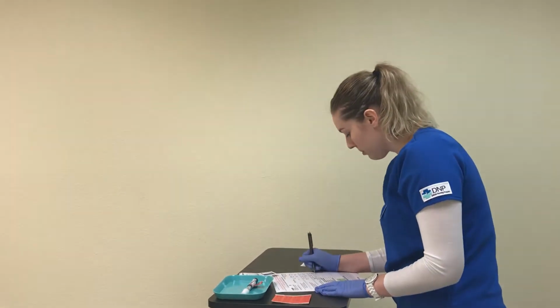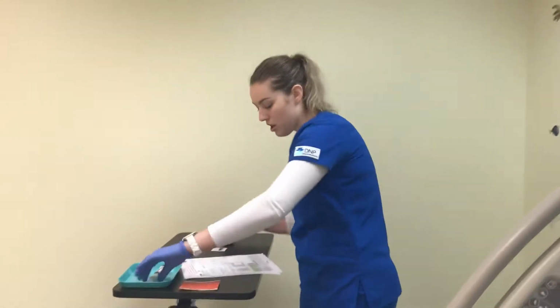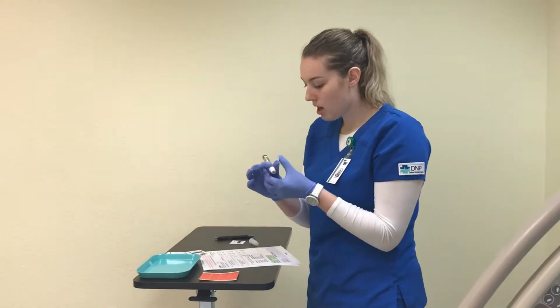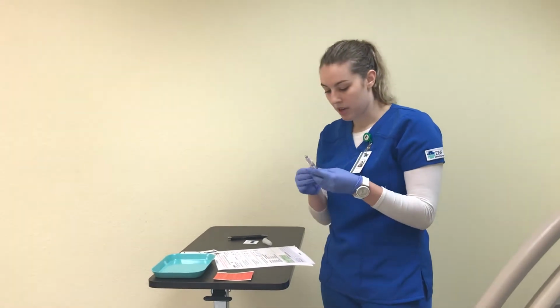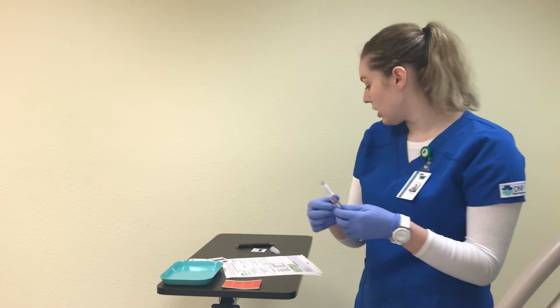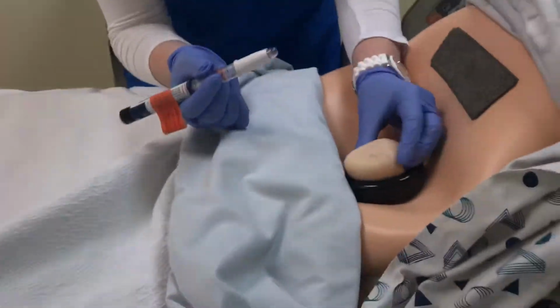So this one I'm going to be giving on the other side of your abdomen. Okay. So this one is your Lispro U100 pen, Insulin Lispro U100, and I have my dial at 2 units, and it's still at 2 units. So I've already decapped it, so now I can go ahead and give the injection, and I've already wiped it down.